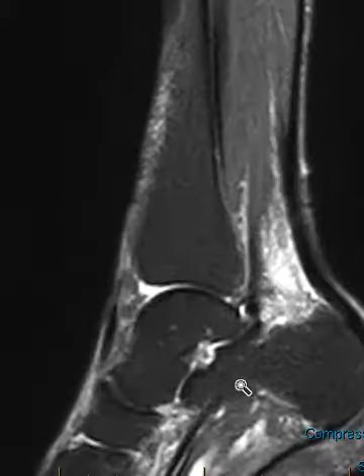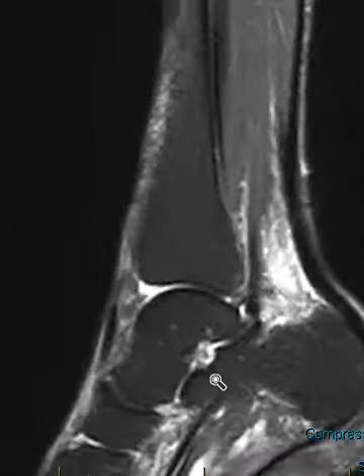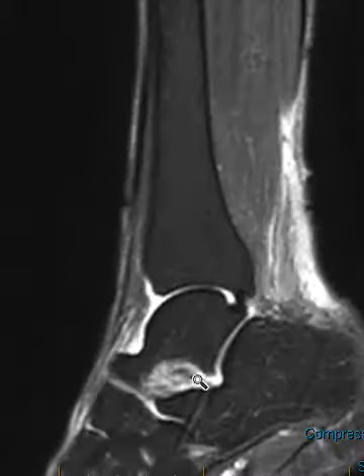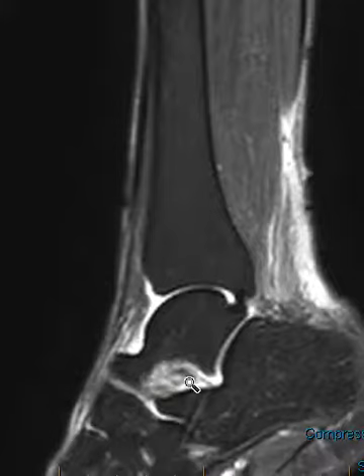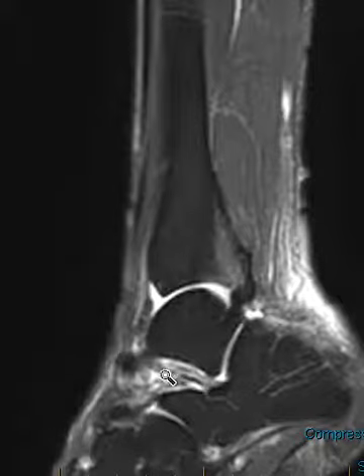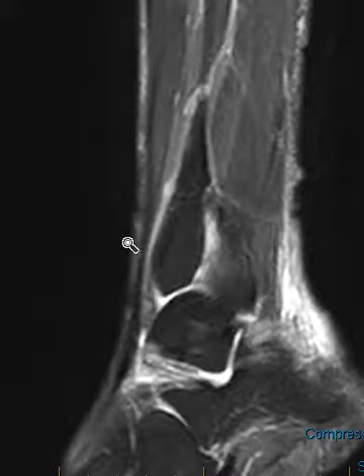Now, if they have prior injuries, then I'll look at these ligaments to see if they're torn. I hardly ever see that, but you have the talocalcaneal interosseous ligament back here, and then more towards the front you have the cervical ligament that comes up here to the neck, cervical, and it's oriented in this direction, and then more superficial if we come out further, we have the inferior extensor retinaculum here, really superficial, that goes up and around, and all those structures look good.